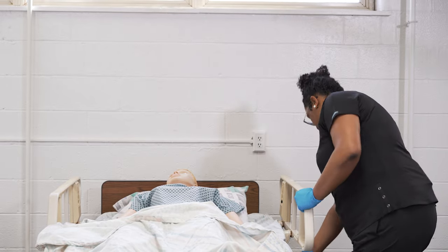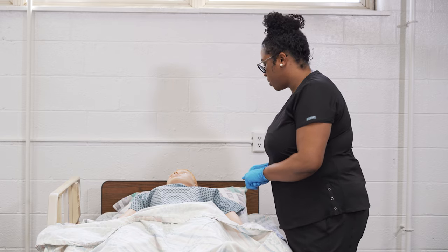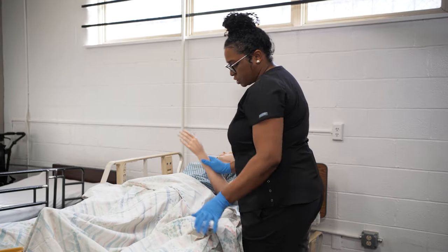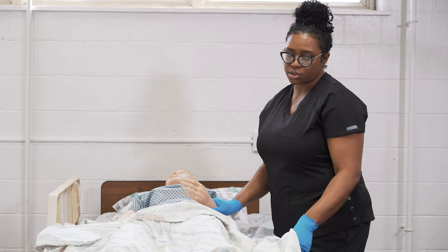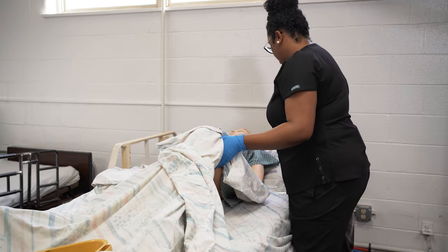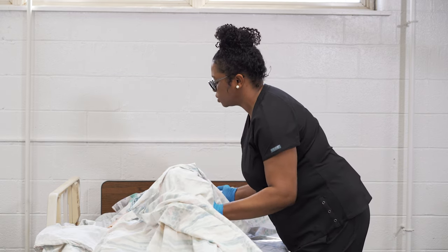Then lower the side rail on the side you're going to be working on and prepare to move the resident away from you toward a raised side rail. Ms. Smith, we're going to prepare to put you onto the bed pan. I'm going to turn you onto your right side. Put the resident into a lateral position — you can do that by either bending the knee of the leg closest to you or crossing at the ankle starting with the leg closest to you. I'm going to bend her knee and place a hand at the thigh and one hand on her shoulder. On the count of three, we're going to turn onto your right side — make sure that side rail is lifted. One, two, three.